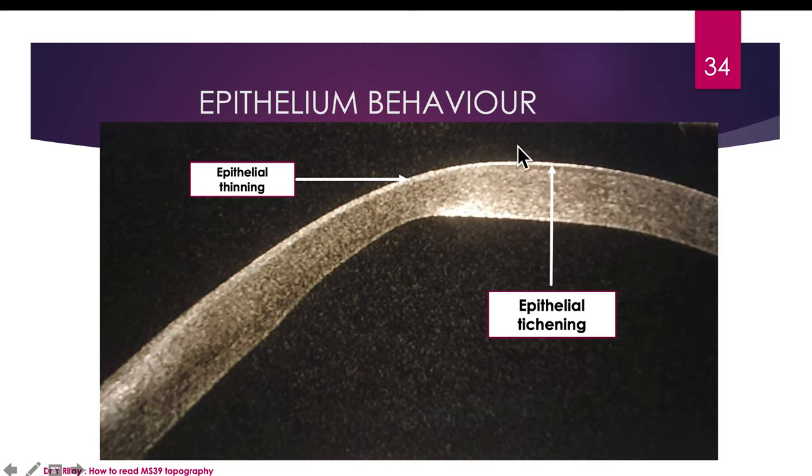And if we do the anterior surface topography, we will see a smooth area of topography. But if we measure the elevation of the anterior surface, it will be less bulged than the elevation of the anterior stroma. That's why the epithelium is misleading.